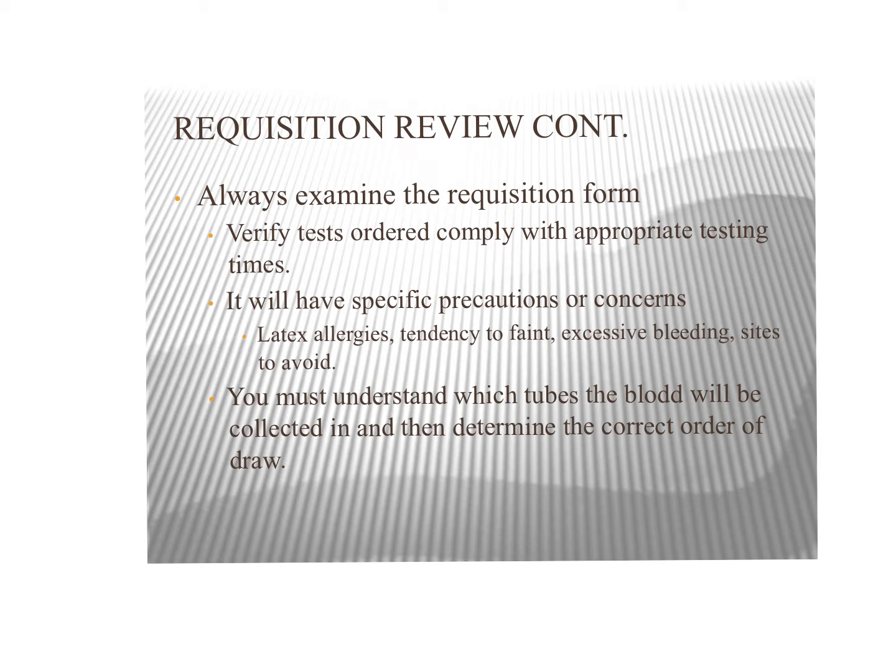You must understand which tubes the blood's going to be collected in, and then determine the correct order of draw. We'll learn later down the line that the tops of the tubes have different colors, okay? And each one of those colored tops is for certain types of testing that the doctors are ordering. So we'll have to learn that and be familiar with that when we're actually on the job, so we make sure that we're drawing the right thing.